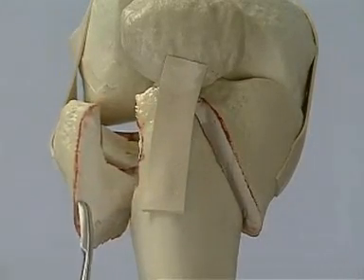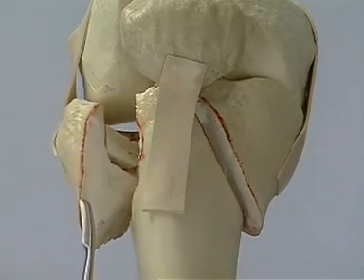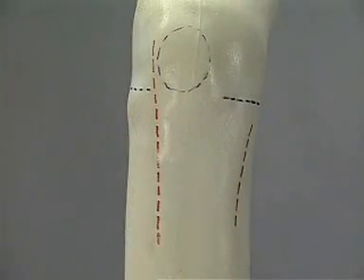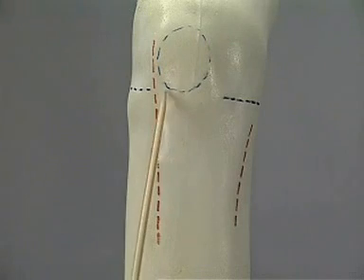To fix such complex fractures we now prefer to use two separate incisions, one posteromedially and one laterally, in order not to interfere with the most delicate soft tissue cover over the tibial tuberosity. As landmarks, we have the patella and the two joint lines.